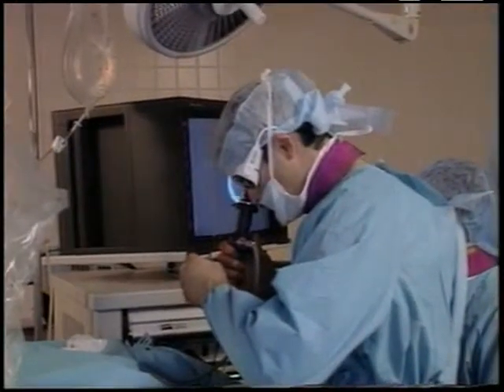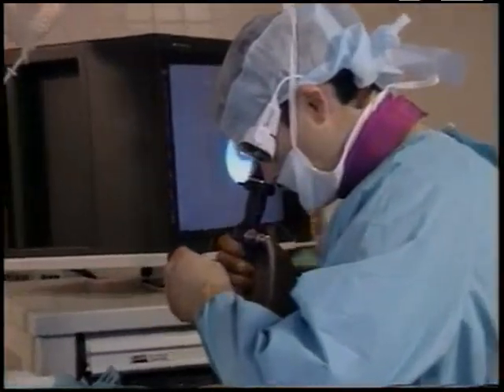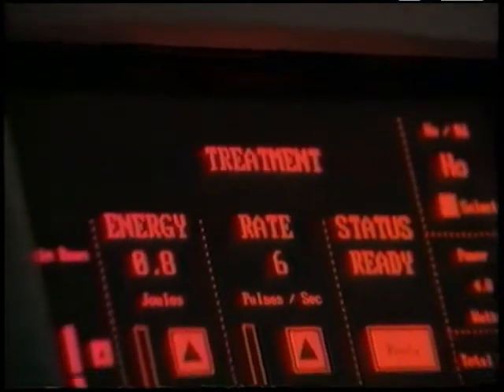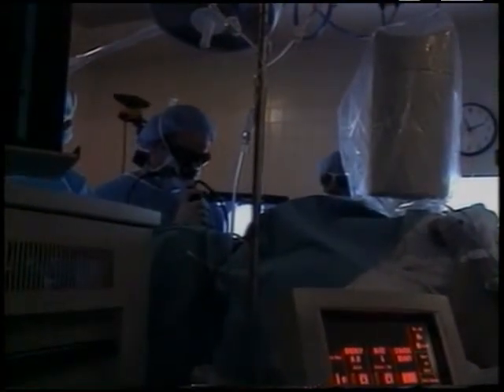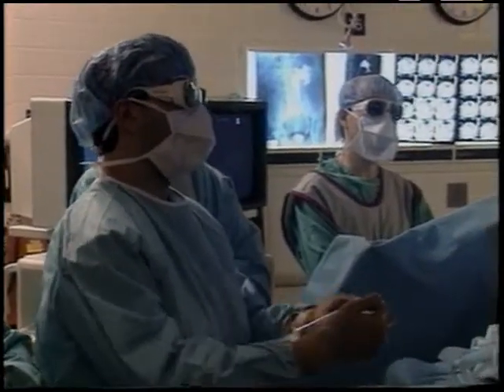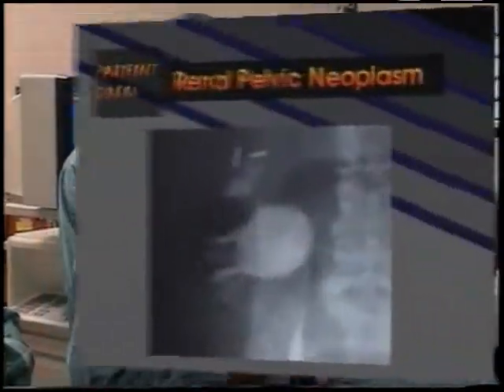The Holmium laser can also be used for soft tissue applications. It has been effective for treating upper tract tumors by actual ablation. The limited penetration of the laser and its effect in removing tissue is particularly useful to clear the ureteral lumen of neoplasm. There is no concern about damage to underlying tissue.